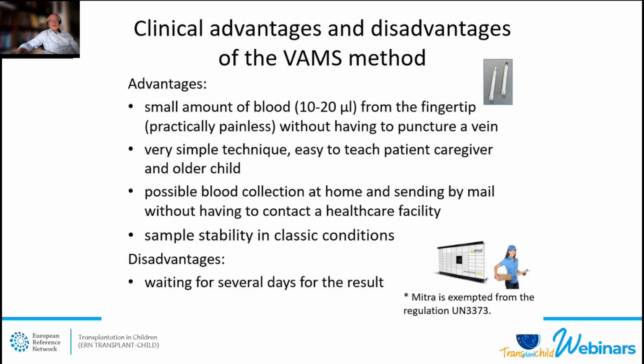And there are some clinical situations in which the VAMS method proves to be particularly useful. In non-adherent patients, we can perform additional C0 measurements between scheduled visits, even every 1 week, and the patient knows that we know whether he or she takes the drug.